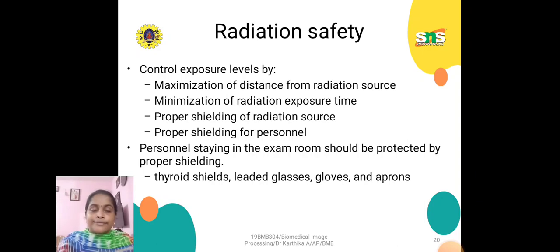And we have some thyroid shields, leaded glasses, gloves, and aprons.